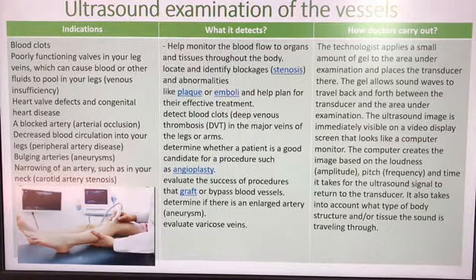Basically, vascular ultrasound uses sound waves to evaluate the body's circulatory system and help identify blockages in the arteries and veins and detect blood clots. A Doppler ultrasound study is a technique that evaluates blood flow through the blood vessels, and it's usually used as part of this examination. The ultrasound does not use ionizing radiation, so it's not harmful, and it provides images of soft tissue that don't show up on X-ray images.